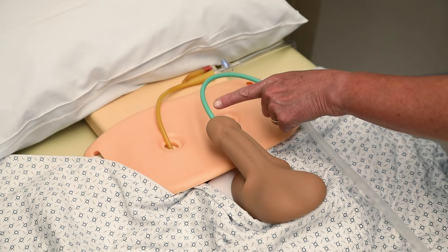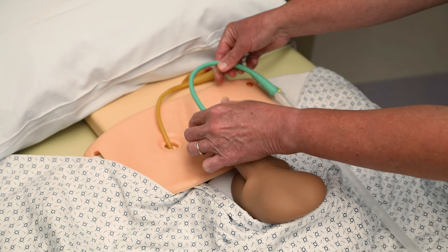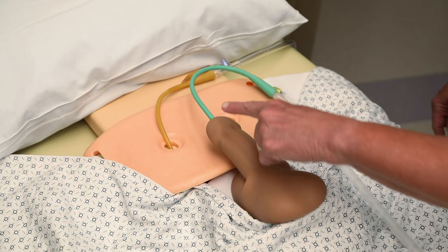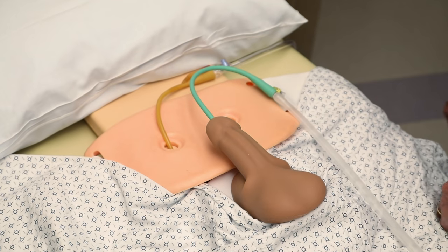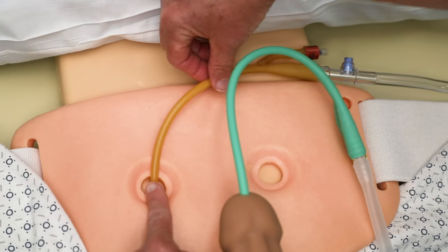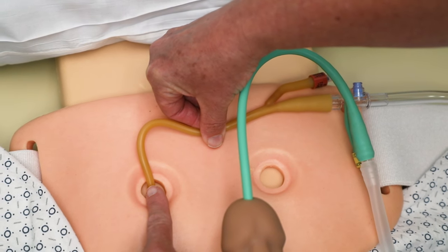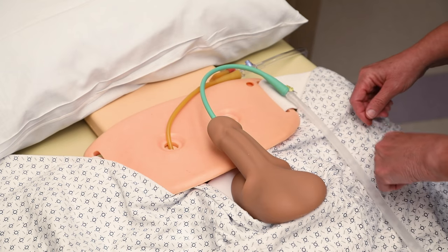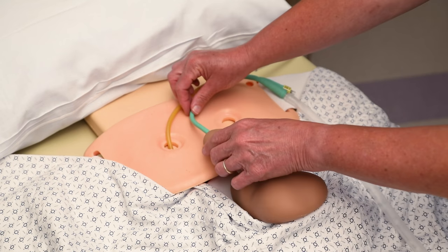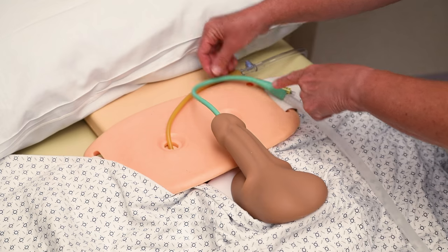Let's begin by starting up at the catheter. Traction on a catheter can be avoided by ensuring a loop or soft bend in the catheter is present between the point the catheter exits your body and the anchoring device. If you have a suprapubic catheter in place, it is important that the catheter be anchored on your abdomen a few inches from where the catheter comes out of your body. If your catheter exits your urethra, the catheter should be anchored on the abdomen or thigh. The location of the anchoring device is dependent on your body's characteristics and the length of the catheter exiting your body.